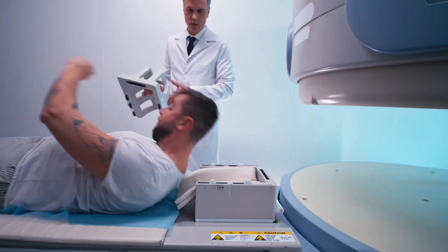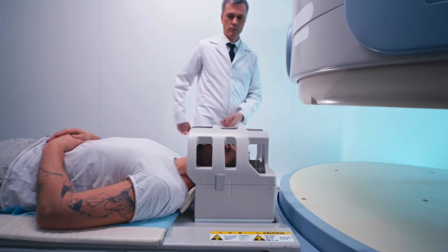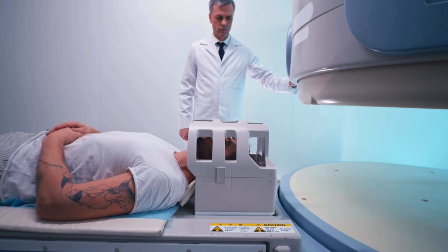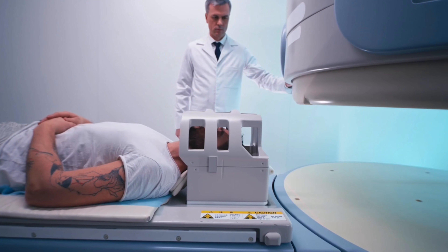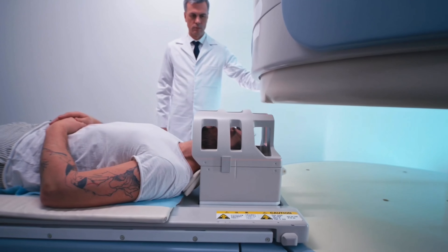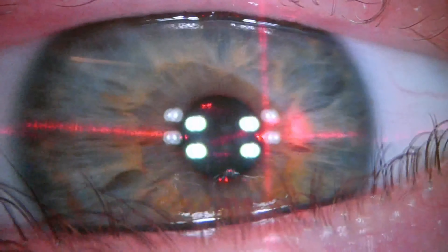So what is the MRI safety concern during this process? MRI scanners use Class II laser assemblies for precision landmark points, such as the nasion and sternal notch. During the landmark process, patients may cross the path of the laser beam. It is important to never stare directly into the laser beam.